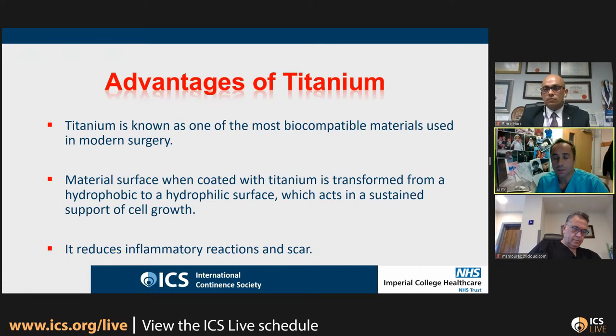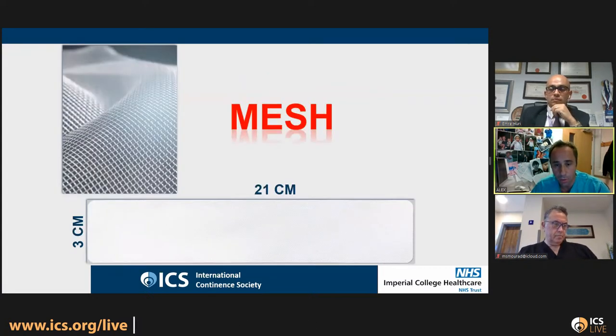Well, what are the advantages of the titanium? Titanium is one of the most biocompatible materials, which normally transforms the material surface from hydrophobic to hydrophilic, and by doing that reduces inflammatory reaction. If I'm able to reduce inflammatory reaction, I reduce the scar tissue formation. If I reduce the scar tissue formation, I reduce the risk of complication, therefore the pain, and therefore the return to normal activity is quicker.